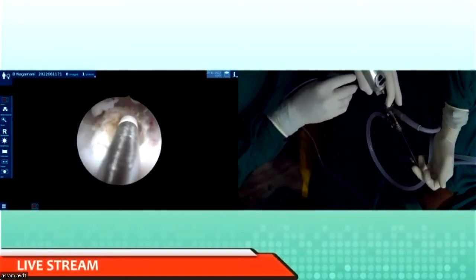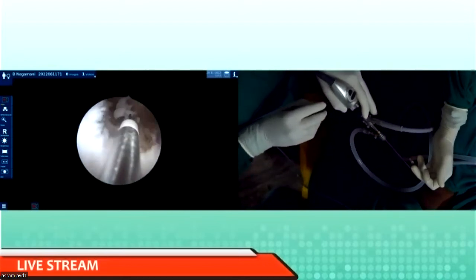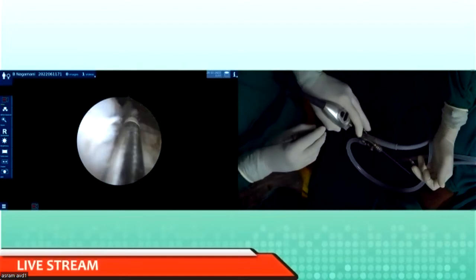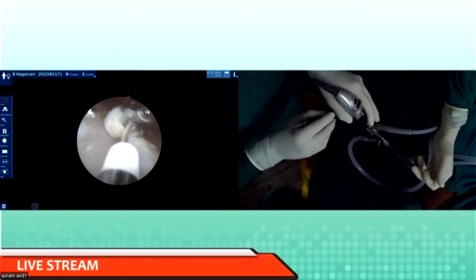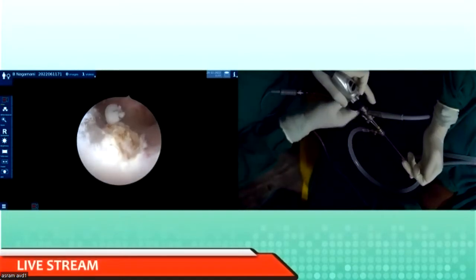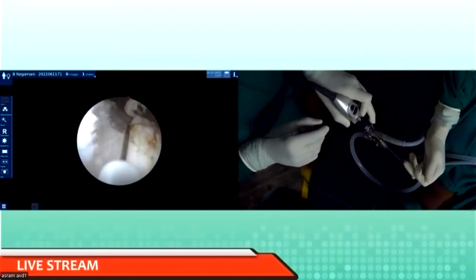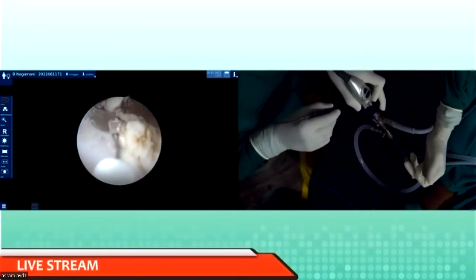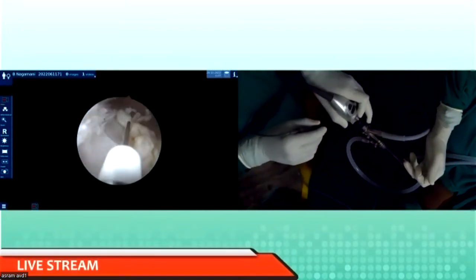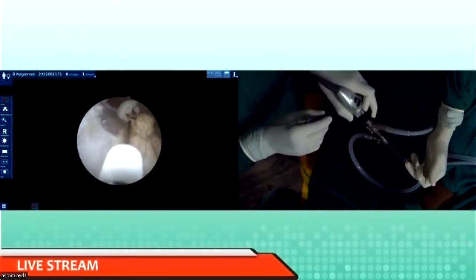And those bits of tissue, you have to pick them up with grasping forceps, or you can just curette it out. Can you see that? So you don't fear that you will have bleeding and all that. Okay, sir, is it clear? Yes, sir. Now my cable is upright. My light cable is at 12 o'clock. Now the entire unit is being swung from left to right.